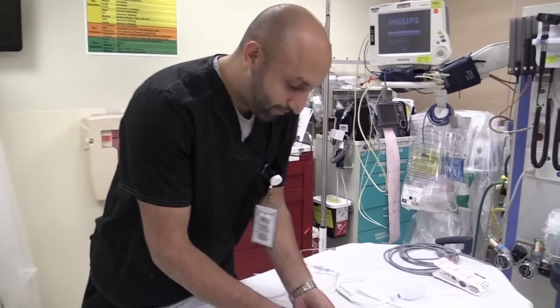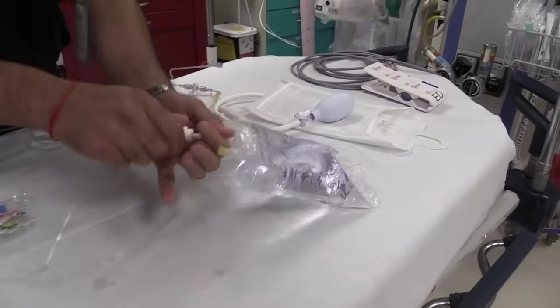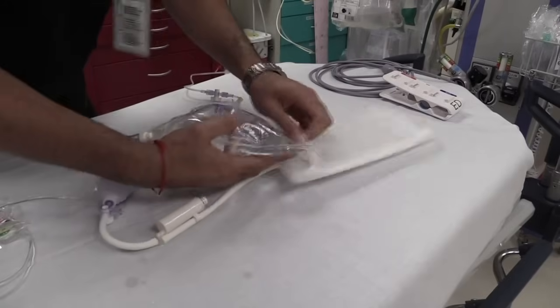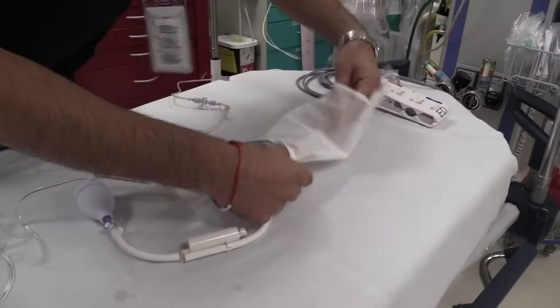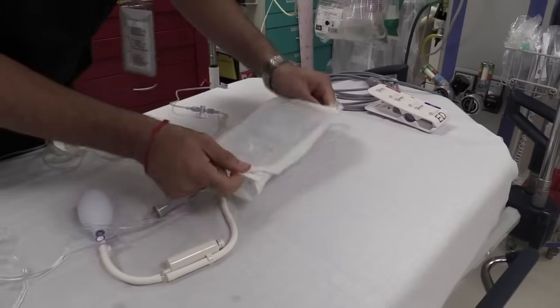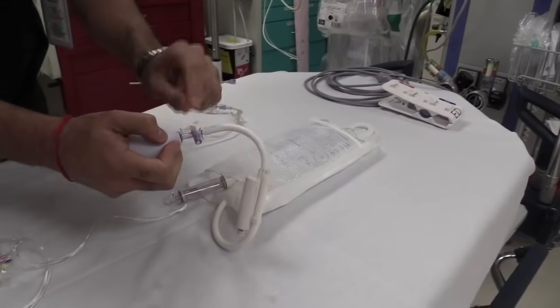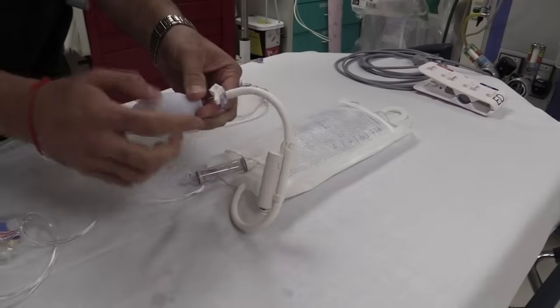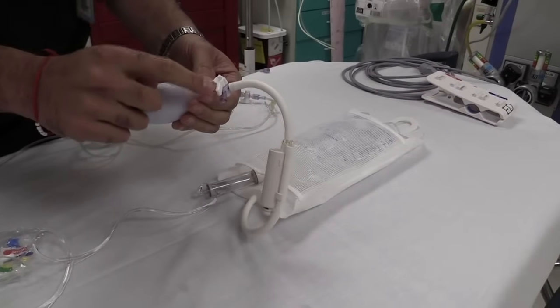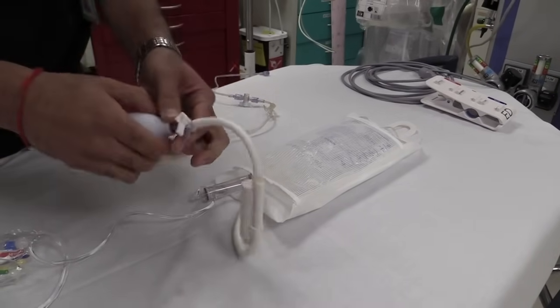Step one is hooking up the pressure bag. You're going to take off the little tab and spike your 500 cc bag of normal saline, and place it into your pressure bag and bring it out on the other side. Then you're going to pump up your pressure bag. Make sure your stopcock — the long arm of it — is pointed out towards the atmosphere. This allows all the air to go from here directly into the pressure bag. Whenever you have a stopcock, always remember the long arm is pointed in the direction that is going to be off.